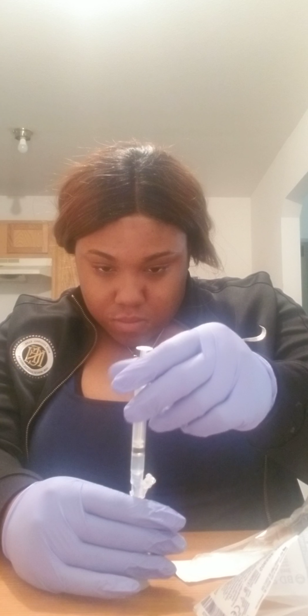Now, we're doing a TB, so after that, we're going to get the patient comfortable. We're going to act like this is the patient. We're going to clean this. We're going to locate the site, and we're going to also clean it. Once we clean it in a circular motion, we're going to allow it to dry.